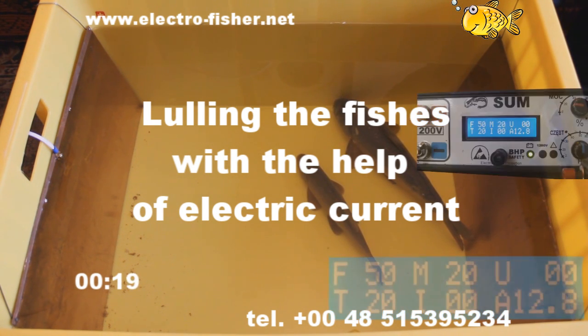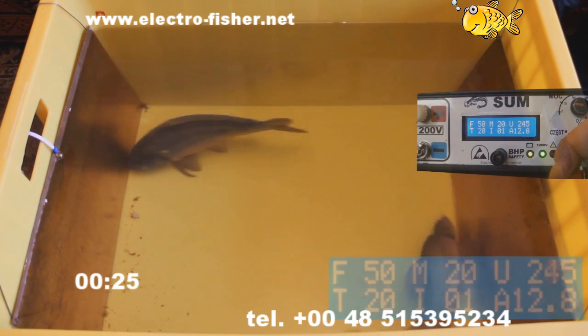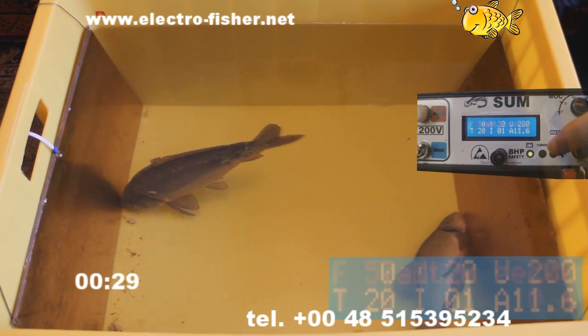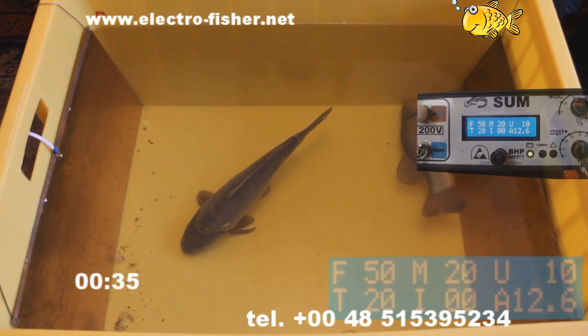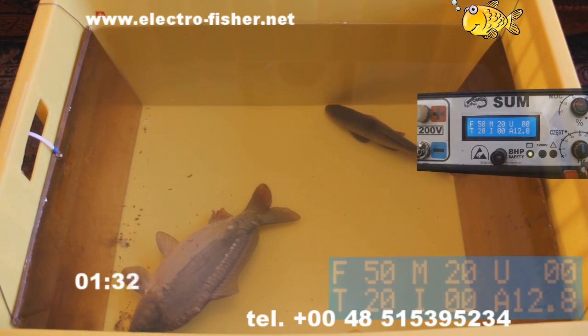The film shows stunning carp and tench. At the moment the electro-fisher is turned on for a few seconds, the fish were anaesthetized. Now, at an accelerated pace, as you can see, the fish come out of anaesthesia, and after a while the fishes are alright.